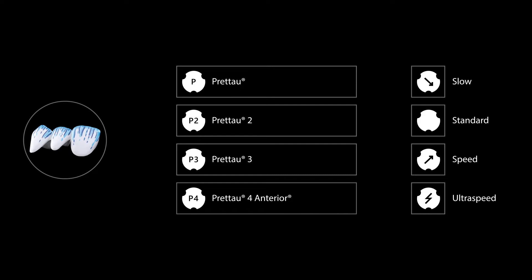To ensure high-quality results and avoid discrepancies in translucency, color gradient, or flexural strength, it is necessary to select the sintering program that corresponds both to the material and structure type.